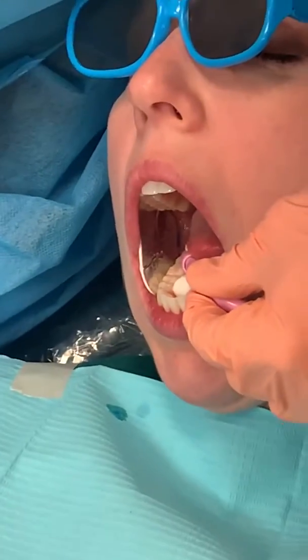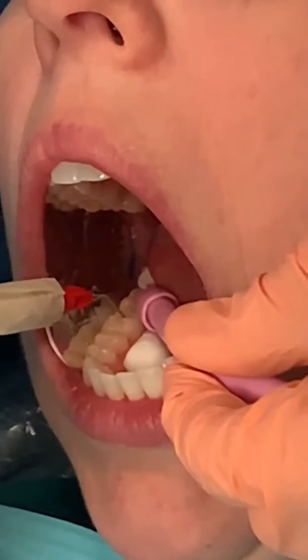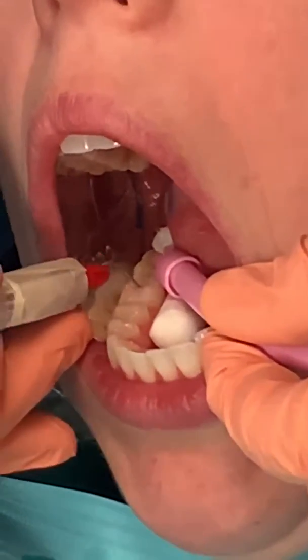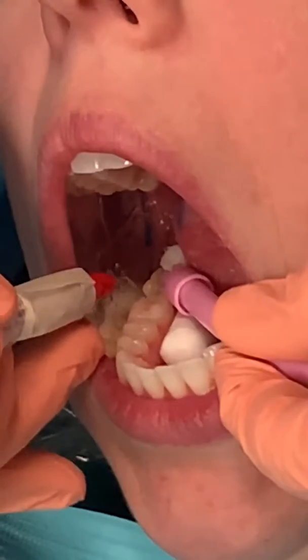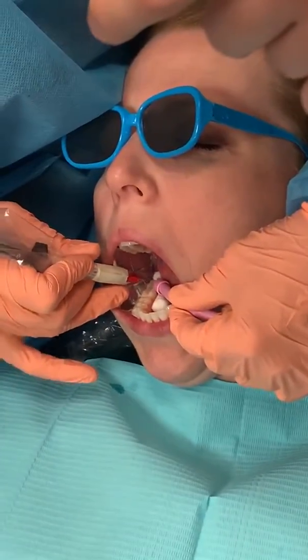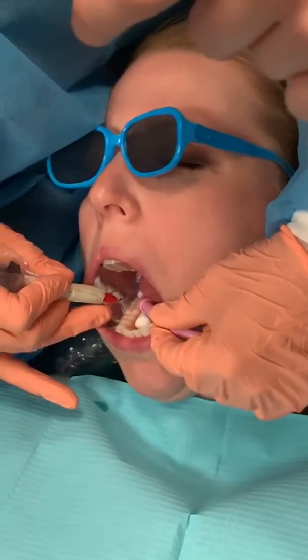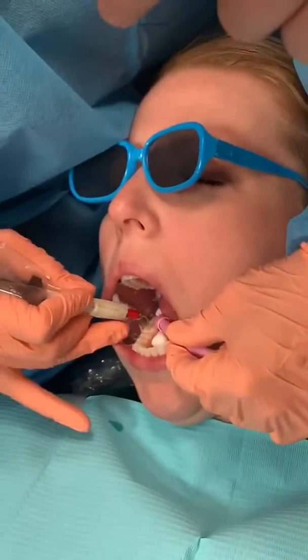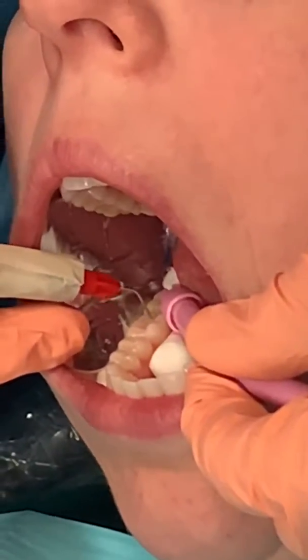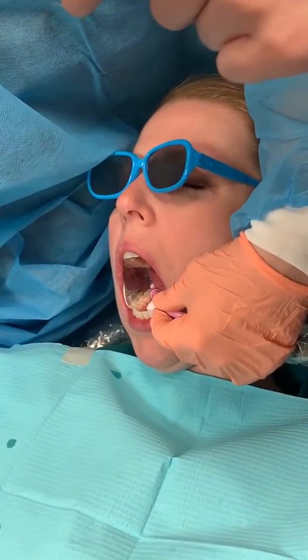And then I'm going to apply some sealant. I grabbed the Quimpro so that you would have a visual. I put a little bit into the occlusal surface there and then I'm just going to spread it out. I'm going to try to go down the buccal groove — hers is not very prominent so I'm really not going to be able to get anything in there. But if the buccal groove is prominent, you do need to get down in that. I feel like I've got a little too much in the middle of the occlusal.